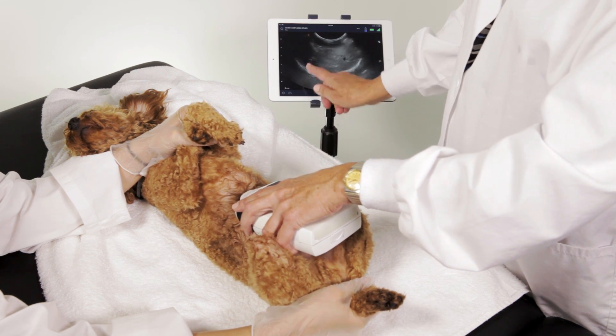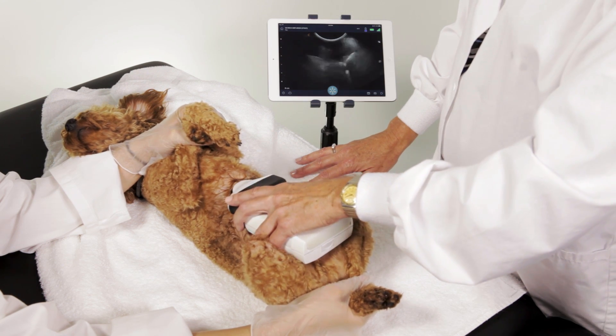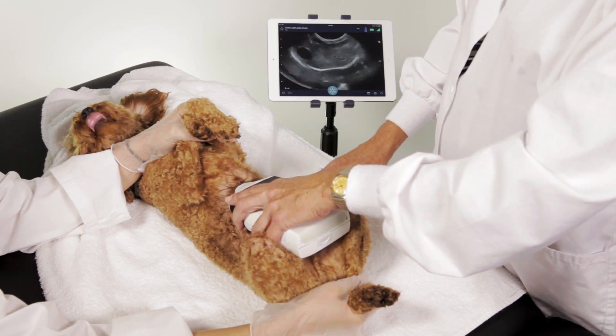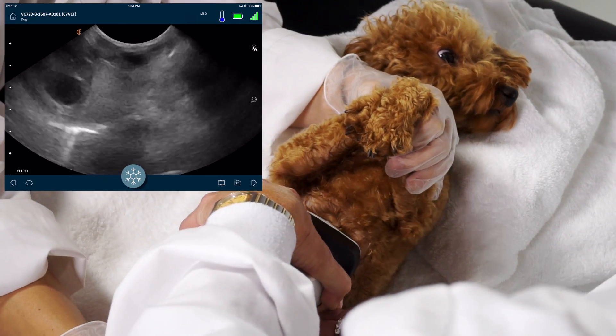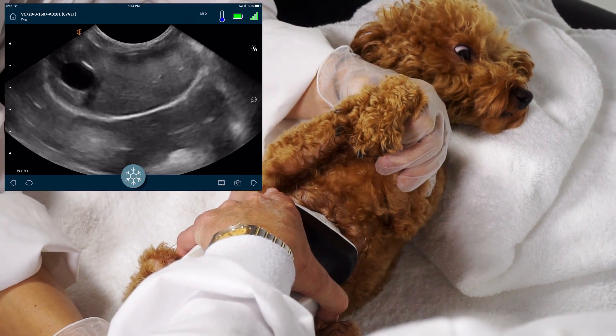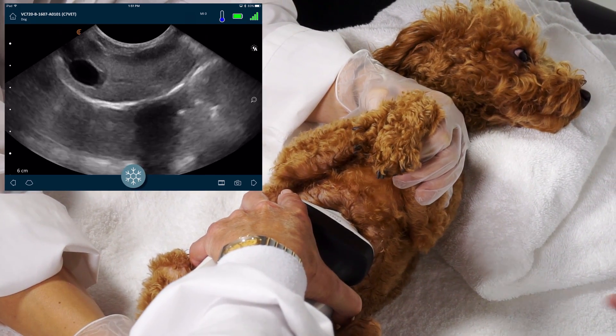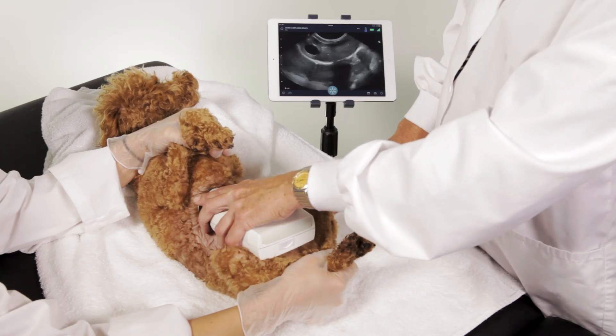You can see the gallbladder nicely here. But what we want to do is angle all the way up so that we get the heart beating. In between the dog's breathing, we're going to see the heart. You can see the heart beating here. And right away we can see that there's no free fluid around the outside of the heart, so there's no pericardial effusion at this time.